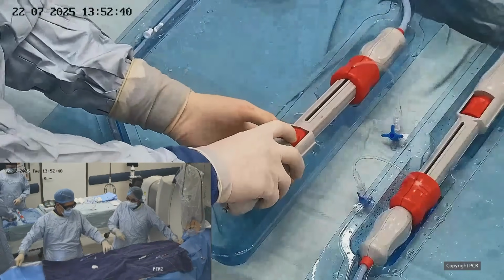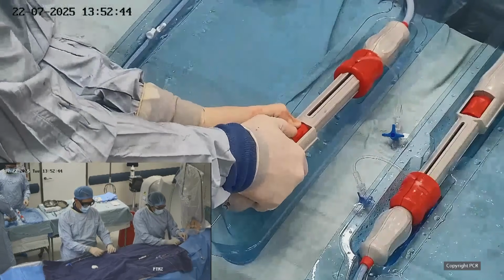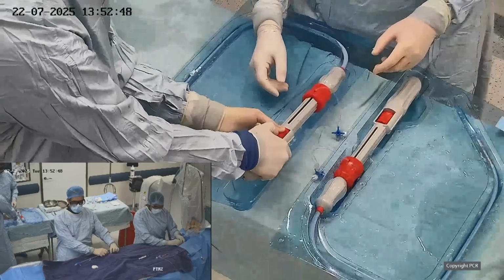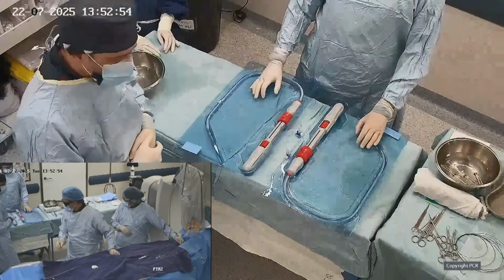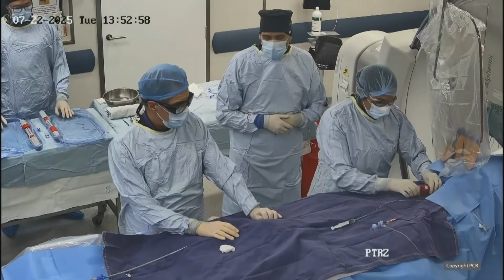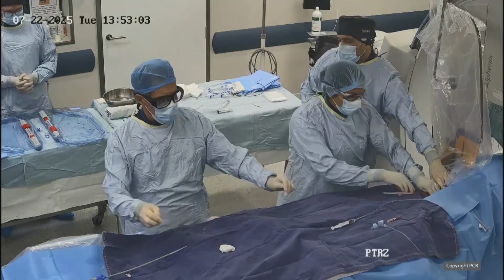It's quite similar with the other system. The mechanism is quite similar. We are going to start with the superior vena cava system, and before we do that, we are going to dilate the groin with the 16 or 18 French sheath.